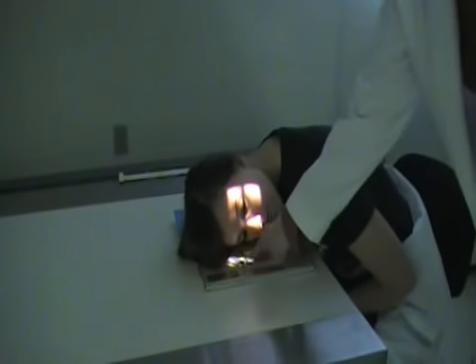And you just collimate to the nose, because we want to have it from the nasion all the way down to the very bottom part where you have the process, the acanthion process. So because the right side of her head is touching, I'm going to put a right marker there. Alright, so this would be our first nasal bone, and then you would do just the opposite for the left side.